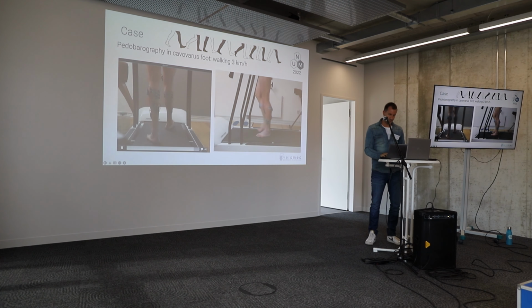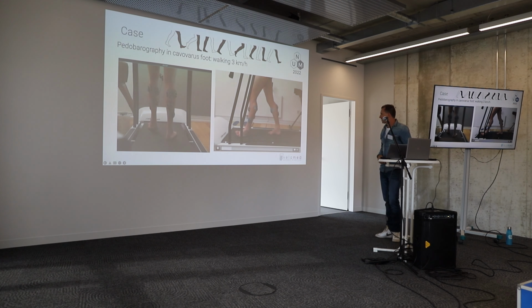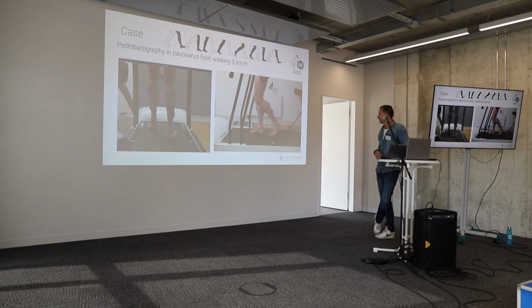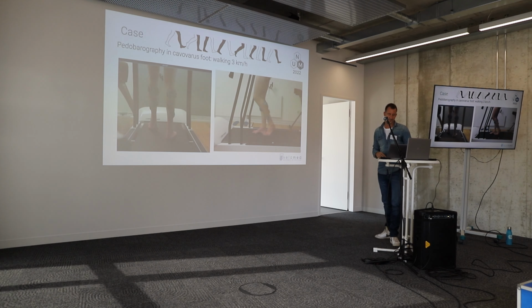Is it a separate video, the right? Yeah. You can see the claw toes and the contracted toes, just to stabilize. So I think we all agree that's not a normal gait pattern.